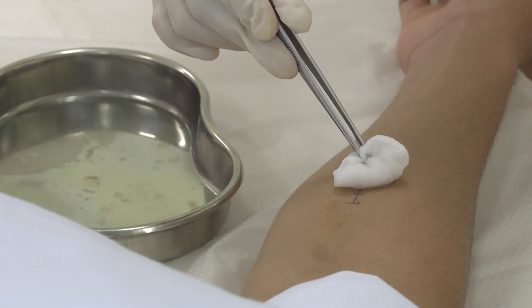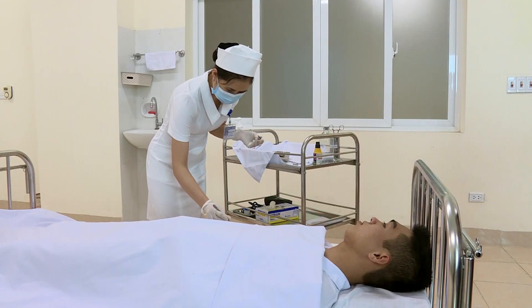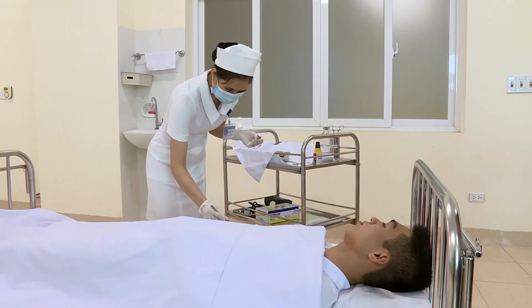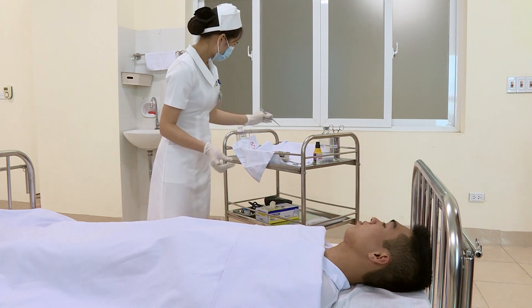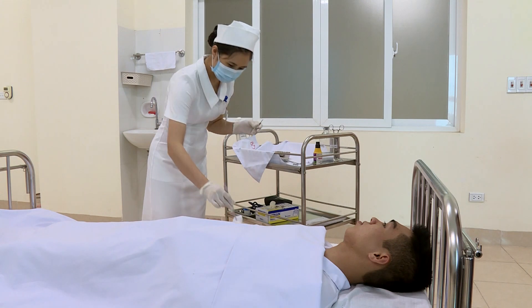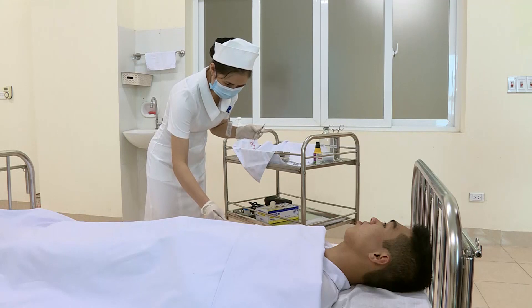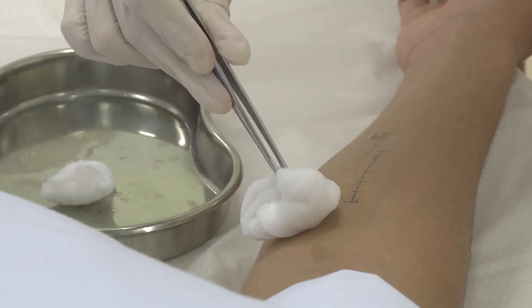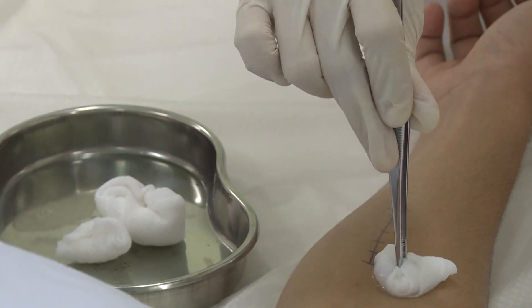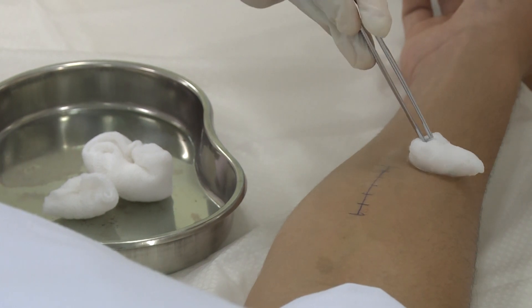Đổ dung dịch natri clorua 0,9% và dung dịch betadine vào 2 bát inox. Điều dưỡng mang găng tay. Rửa vết thương bằng dung dịch natri clorua 0,9%: tay không thuận cầm kẹp để gắp bông cầu trong bát inox, chuyển sang kẹp bên tay thuận để rửa vết thương. Rửa từ trên xuống dưới, từ trong ra ngoài đến khi sạch. Thấm khô, ấn kiểm tra vết thương bằng gạc hoặc bông cầu xem có dịch không.